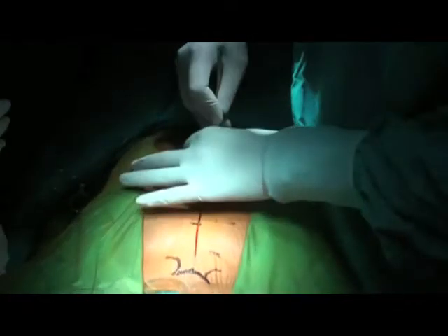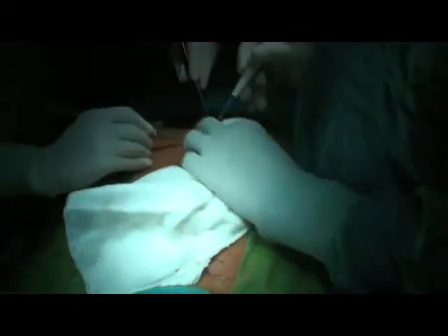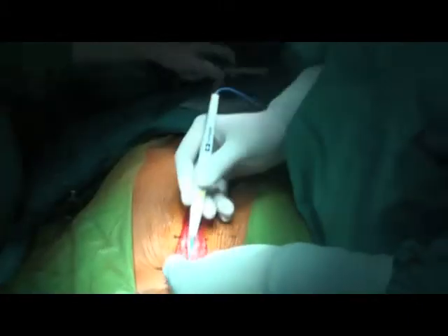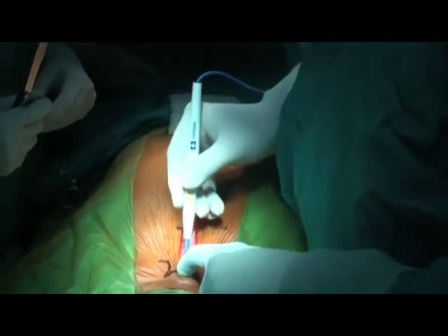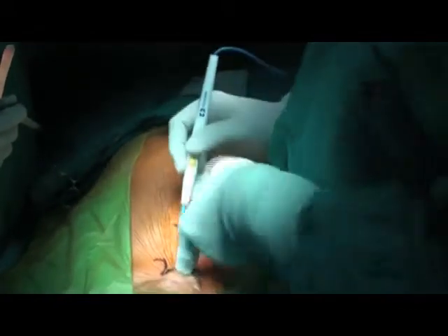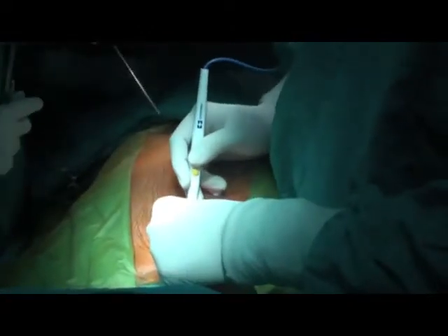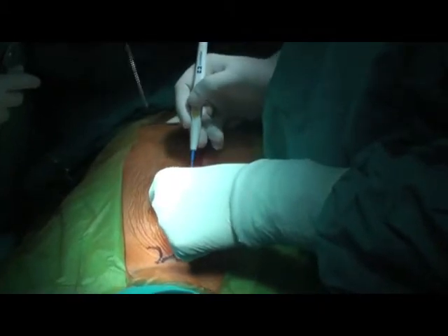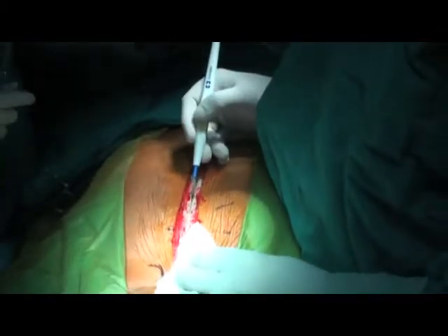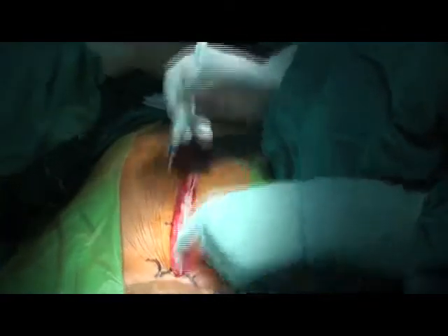I normally do not cut using the diathermy because it will burn the skin. I recommend using diathermy only at the bleeding points. The dissection is done in the midline and in the suprasternal notch, taking care of the interclavicular vein. You cut the periosteum right in the center with your index finger and thumb of the left hand. Periosteal bleeders are coagulated using a coagulation setting of 40, and the smoke and bleeding are sucked with a fine sucker.